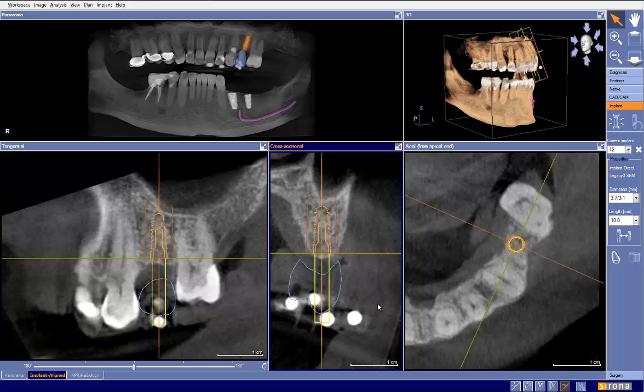Now, will this work? Of course, a custom abutment can fix it. Many things can fix that. But the big difference here is that now we can't go screw retain. Now we're going to have an off-axis loading and D3, D4 bone, which isn't as strong bone as we would like. So there are a lot of negatives here. So what I would like to do is back up and let's plan this with our checklist without benefit of the CEREC data. And then let's put the CEREC data in and see.